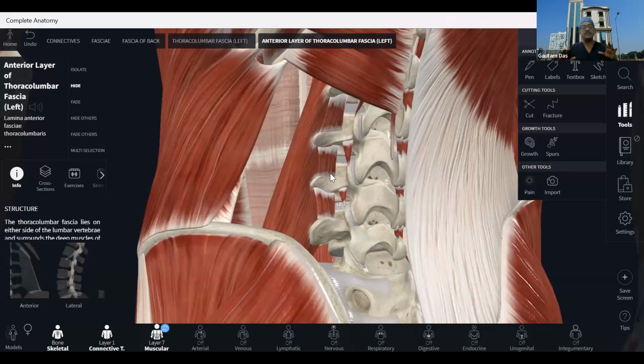The transverse process is making the divisions. Within the two transverse processes is your intertransverse muscle and ligament. Anterior to that transverse process is your psoas. Posterior to that transverse process is your erector spinae. Lateral to that transverse process is your quadratus group of muscles. And in the erector spinae group, we are having three muscles. Most medially and deeper is your multifidus. After that, longissimus. After that, iliocostalis. And in the thoracic area, another muscle is your spinalis muscle. Okay? Is it clear?